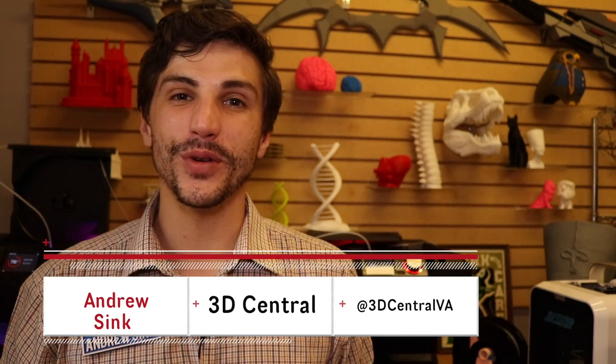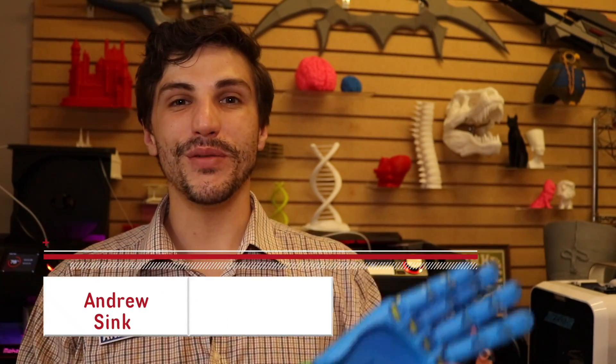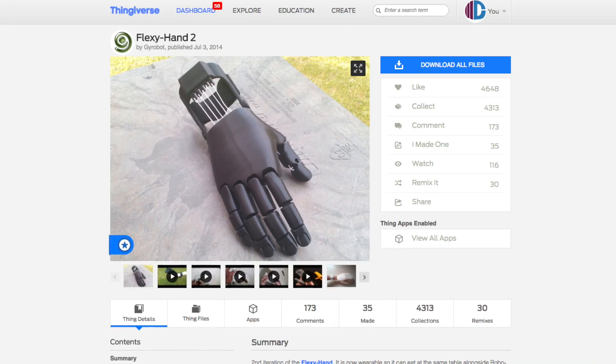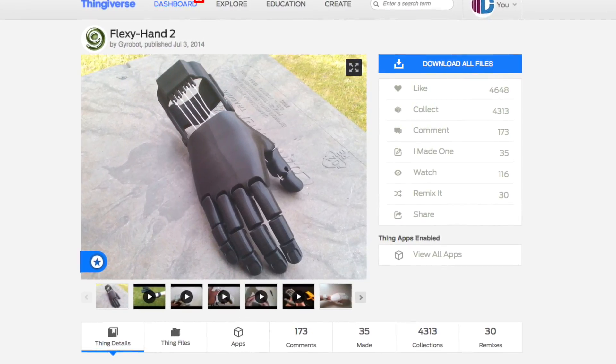How's it going 3D printers? Andrew Sink from 3D Central here and today I'm here to show you this — the FlexiHand 2, uploaded by Gyrobot on Thingiverse to be part of the Enable project.